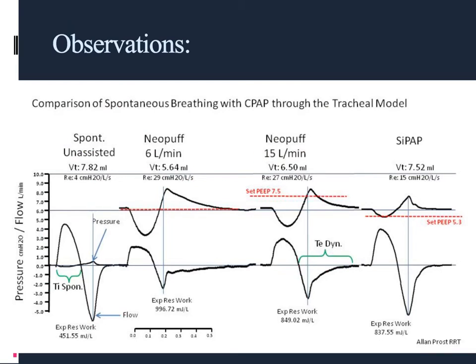So I think these are positives. You just need to make sure that you correct for the error in the NeoPuff pressure manometer, which is induced, I think, by some of the internal flow dynamics of the NeoPuff. This could be improved dramatically if we actually measured the pressures directly at the PEEP valve instead of back inside the ventilator.